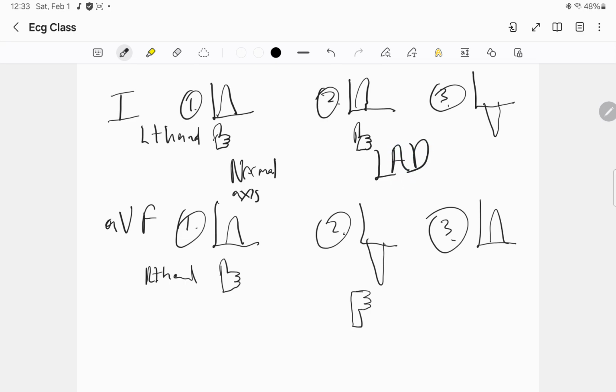All right. And then let's look at example number 3. So put your thumbs up. My left thumb is going down, right? My left thumb is going down and my right thumb is going up.